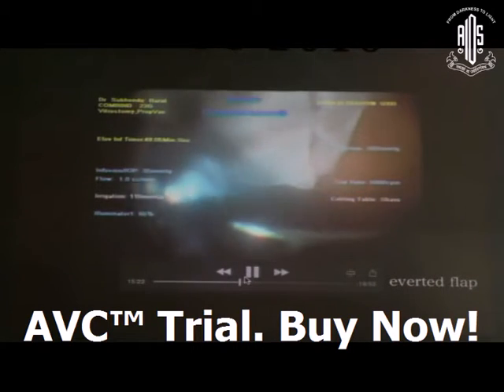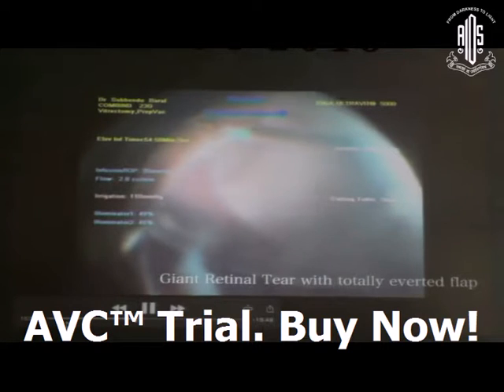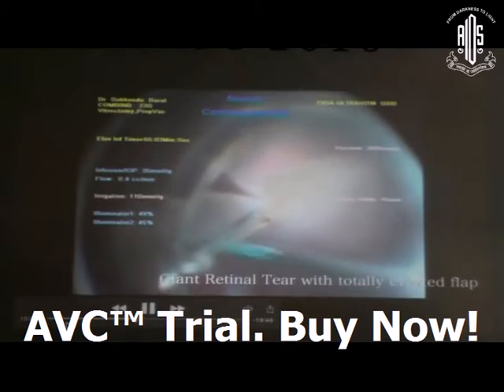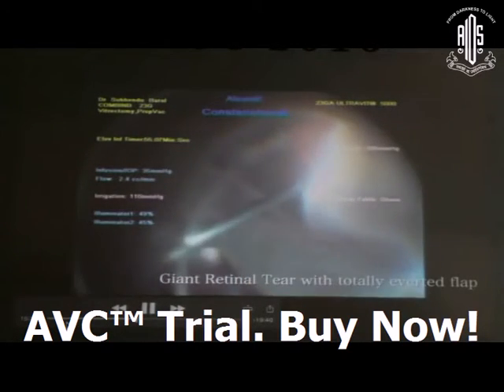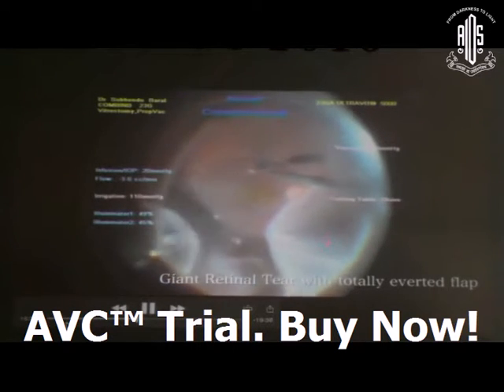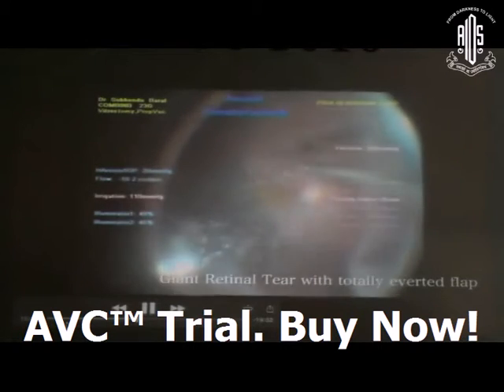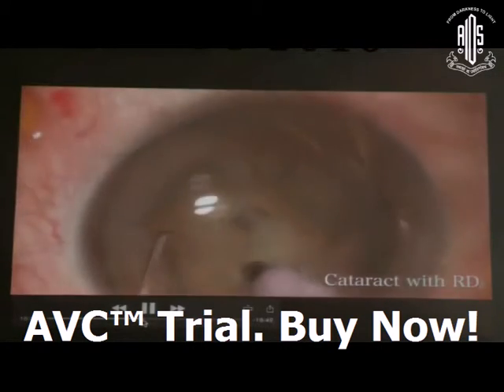Now coming to another situation where the giant retinal tear flap is totally everted — everted margin of the GRT flap. In this situation, you have to invert it again, inject PFCL just over the retina to re-appose the retinal flap, do fluid exchange, and do laser.